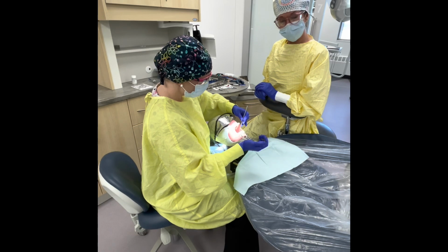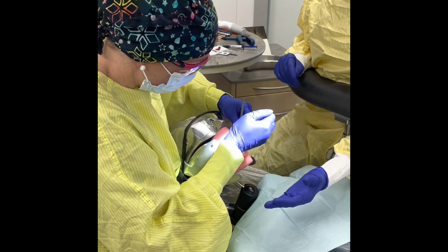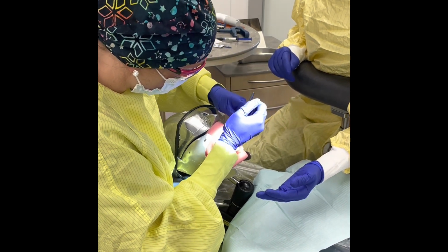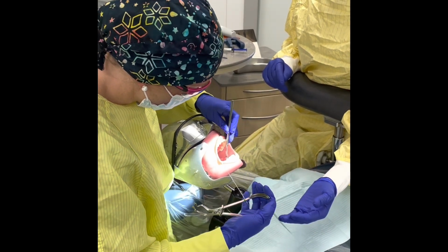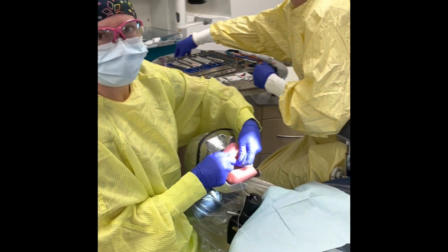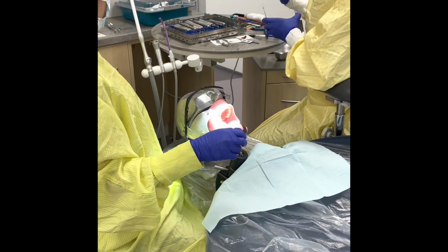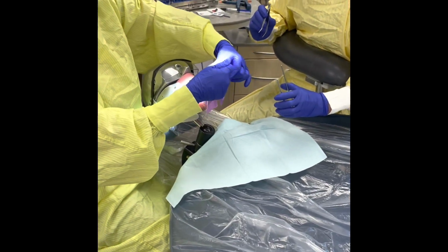I'm going to come in with my mirror and place my clamp. Okay. Stacy will take the forceps. I'm going to ensure my clamp is stable. Then I'm going to set my mirror down, bring in my dental dam.